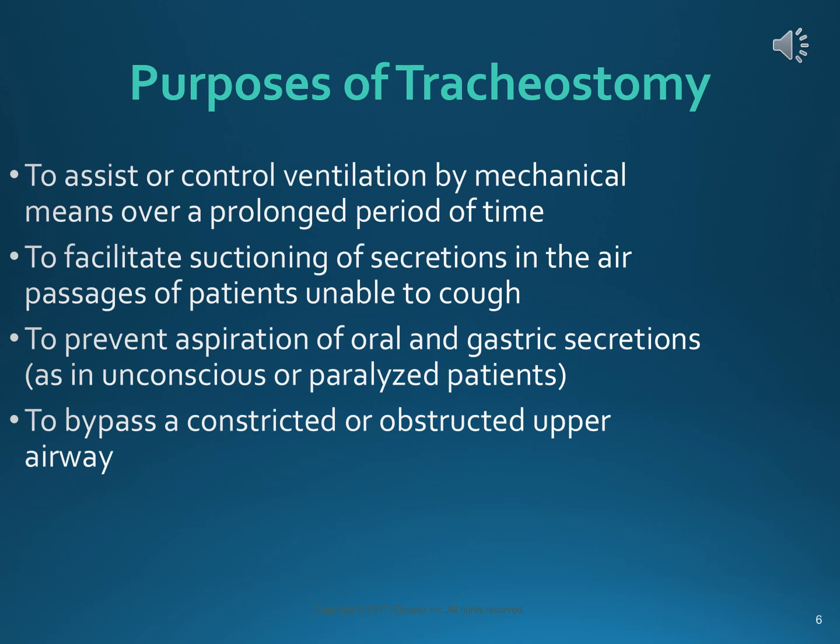So why would you do a tracheostomy, which is not totally a permanent procedure, but it's certainly more of a permanent and invasive procedure than an ET tube? Well, first of all, let's talk about ET tubes. They're really good for quick establishment of an airway, but over time, that balloon can erode the airway, and it's not good to leave them in for a very long period of time.